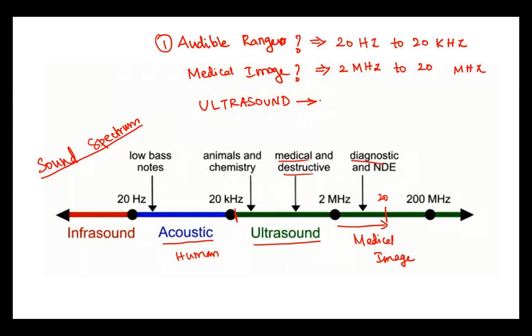In many competitive exams, GATE exams, and interview questions, they ask what frequency range ultrasound imaging works in. So you are given some frequencies. Just tell me in which frequency range your ultrasound will work at a very high resolution. Low frequency or high frequency? High frequency, sir. High frequencies are preferred for getting an ultrasound image.